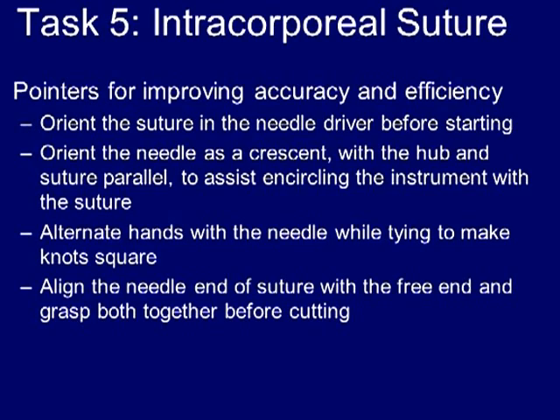It is expected on the FLS exam that you alternate hands with the needle when tying each successive throw in order to lay down square knots. Although in a practical setting the needle may not switch from one instrument to the other in order to form an intracorporeal suture, alternation is expected on the FLS exam.